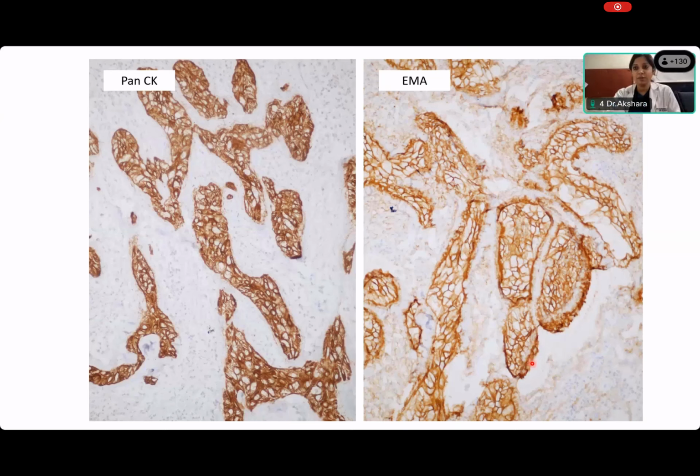EMA is negative in myoepithelial cells. So these are exactly. EMA is negative in myoepithelial cells. Okay. So it has to be an extremely odd myoepithelial tumor to express EMA. So with two simple stains, and you saw it. You saw this CK and EMA in the clear cell carcinoma. So here we have this. So it's not a myoepithelial cell tumor because there's EMA positive.